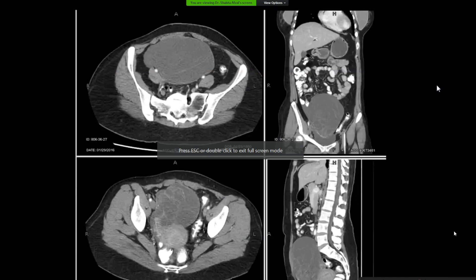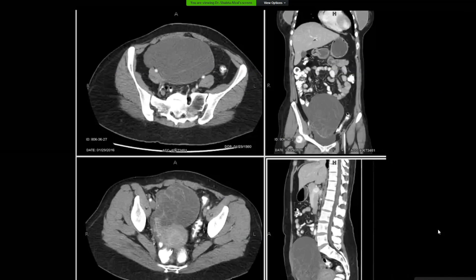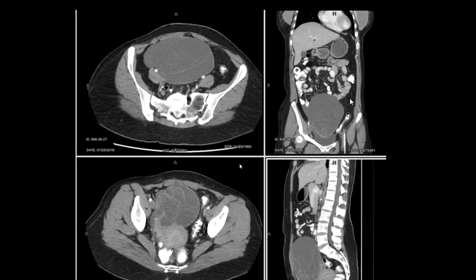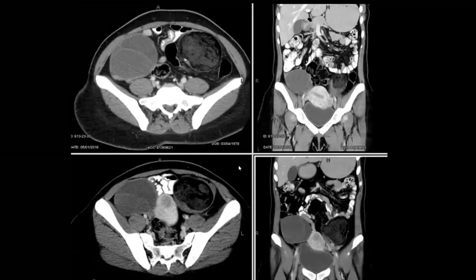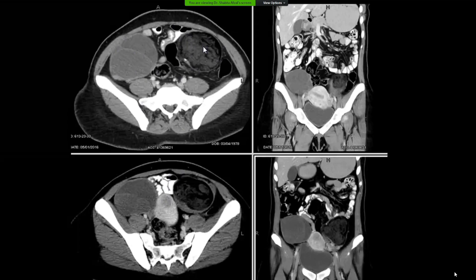Whenever you see an ovarian cyst, look for the septa, the solid component, and in this case, you see multiloculated large cysts. Look for size as well; some ascites is present along with peritoneal nodularity on the left side — a suspicious cyst requiring further workup. This case shows two types of abnormalities: a septated right ovarian cyst, a fibroid within the myometrium, and a mixed density predominantly fat density lesion in the left adnexa — the diagnosis being a dermoid.